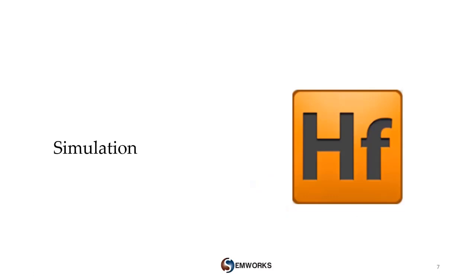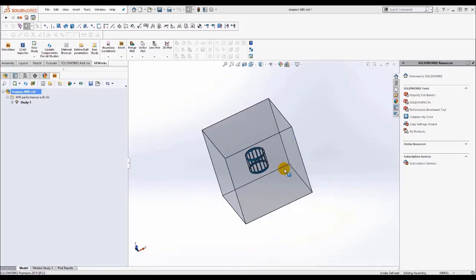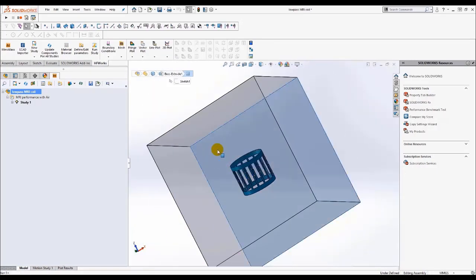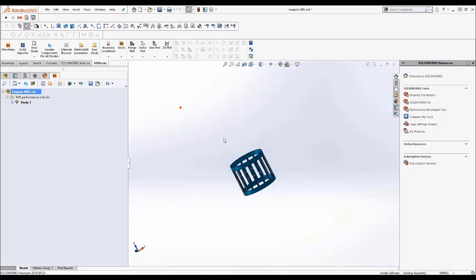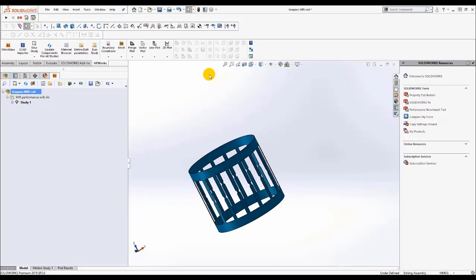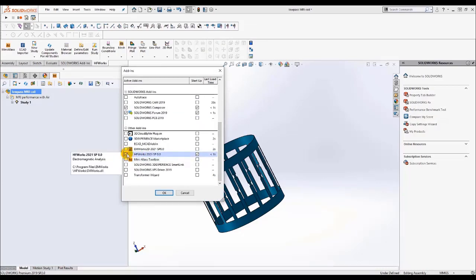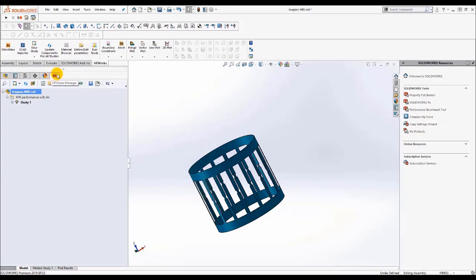But before moving to the simulation and results, let's have a quick demonstration of the HFWorks interface inside SolidWorks. So here we are. This is our SolidWorks interface with the birdcage coil design and also the outer surrounding air. We can hide it. So as we said, HFWorks is an add-in inside SolidWorks. So if we check from here the add-ins window, we can find it here. Once it is checked, an HFWorks tab manager will be added automatically with all main features. And also from this interface we can create our analysis and also run it. For those who already attended, they may know that, but for our new attendees, we will try to create a new study from scratch.